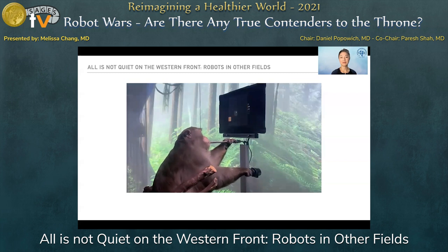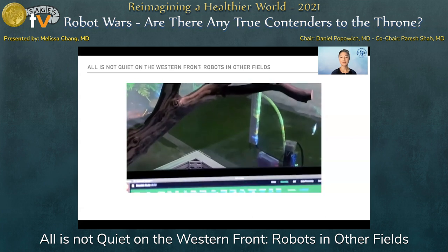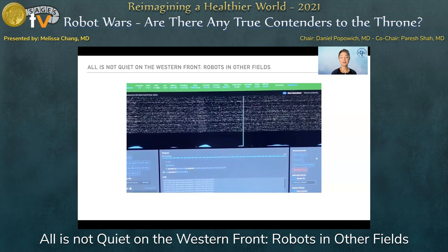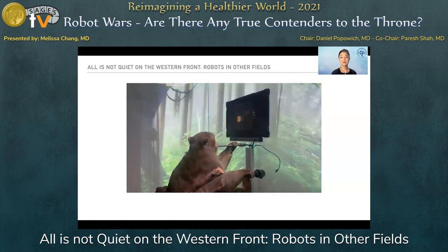First, we calibrate the decoder by recording neural activity as Pager uses the joystick to move a cursor to targets presented on the screen. As he's playing this game, we are wirelessly streaming, in real time, the firing rates from thousands of neurons to a computer. Using these data, we calibrate the decoder by mathematically modeling the relationship between patterns of neural activity and the different joystick movements they produce. After only a few minutes of calibration, we can use the output from the decoder to move the cursor instead of the joystick. Pager still moves the joystick out of habit, but as you can see, it's unplugged. He's controlling the cursor entirely with decoded neural activity.